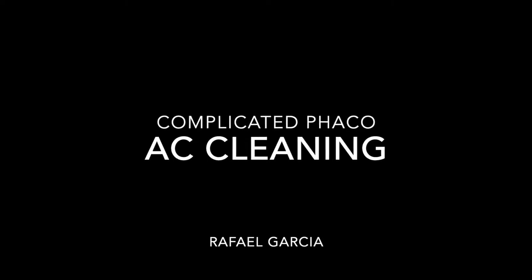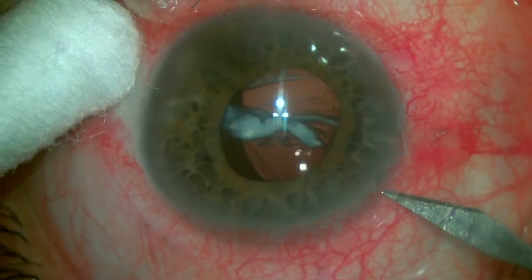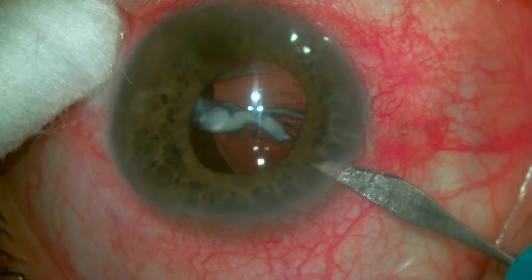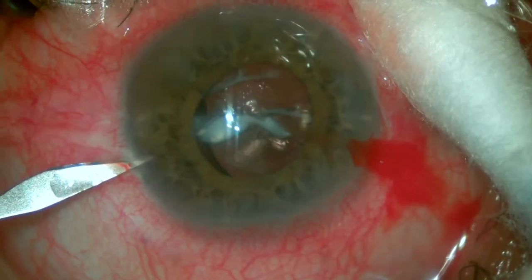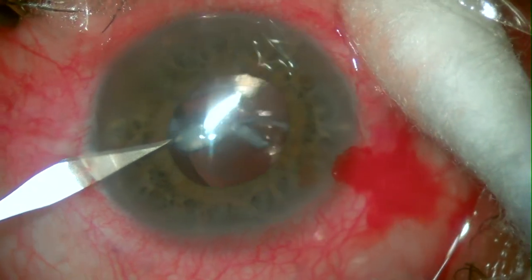This case is a complication of a cataract surgery performed a couple of months ago. We can see a great amount of cortex material in the pupillary center of this patient, blocking his visual access. Since the IOL is reasonably stable, the idea here is to be minimally invasive and basically perform an anterior vitrectomy to clean up the anterior chamber.